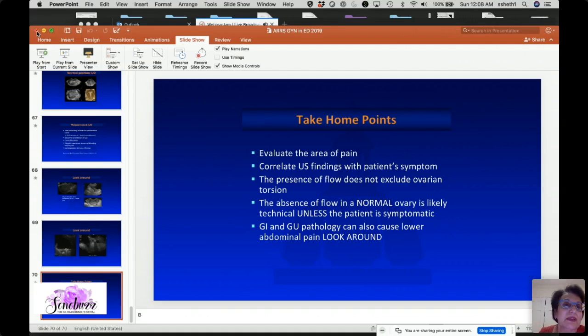Ma'am, there are questions, and first of all, thank you once again. You have been taking so many important things together in one go. So really commendable, ma'am. And there's a question: they want to know how to differentiate oophoritis and torsed ovary, as Doppler may be normal in initial phases of torsion.